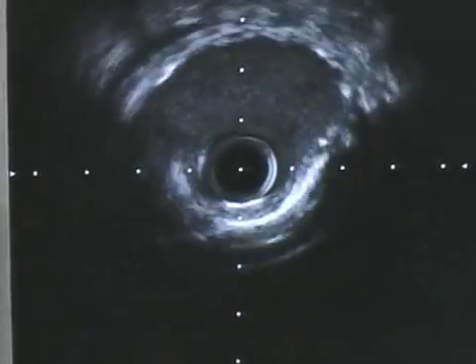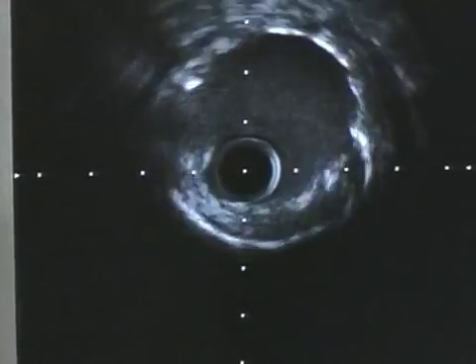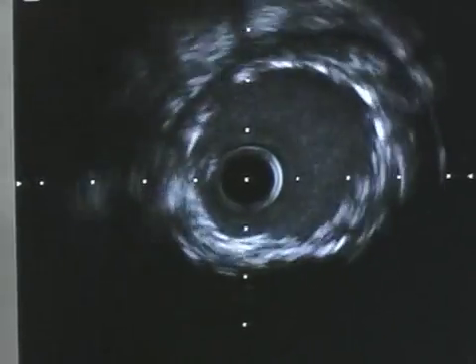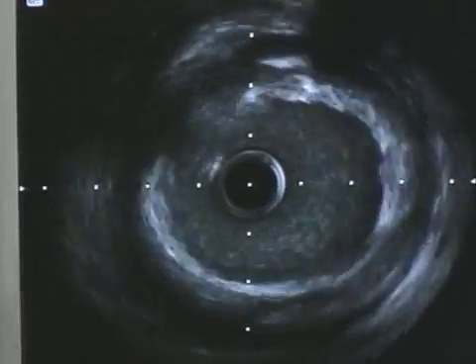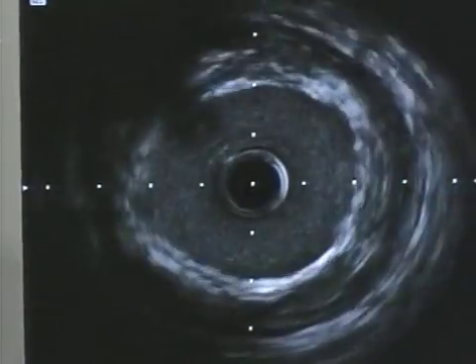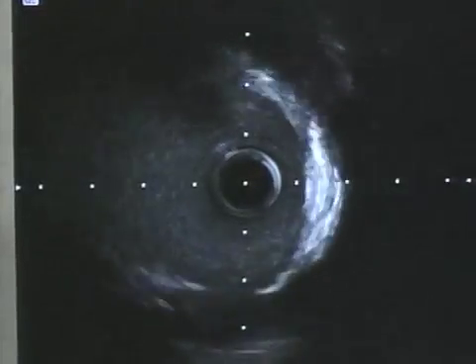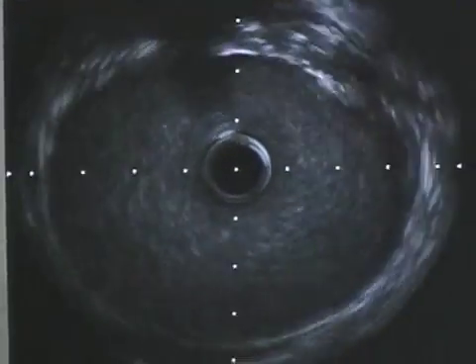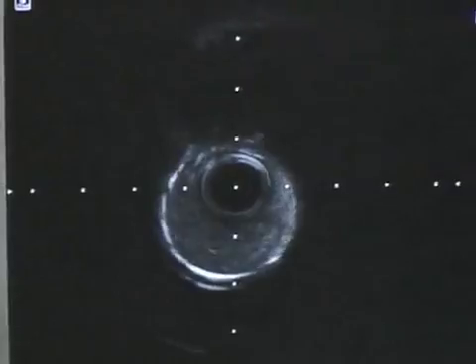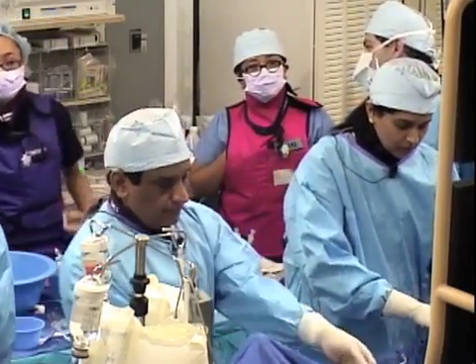So now if you see here, you have a good stent opposition. Yeah, although in one area in the center, you see there is still less, we'll check into the lumen cross-sectional area. Maybe it will require the 4.0 by 8 millimeter and go to 4.5, just in the short area, to about 20 atmospheres in the middle part of the lesion, which we saw in another view. Yeah, take this out.